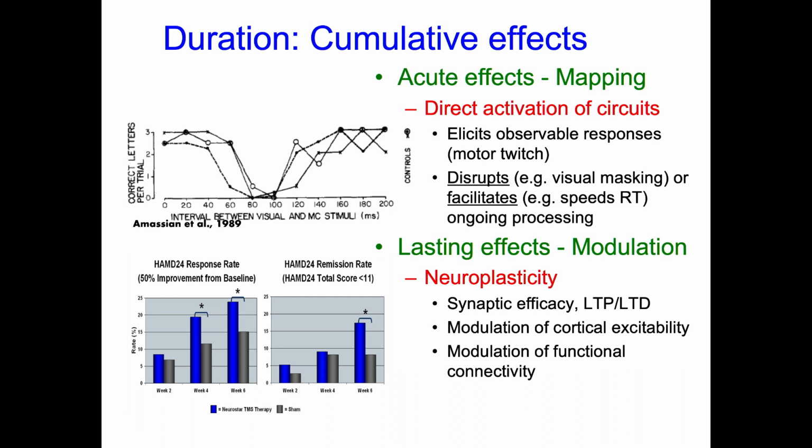That kind of effect, you're changing synapses in a way that the synapses are responding to the stimulation and adapting to it, and they're actually changing their properties, and that lasts for a little while until it all returns to baseline. You can make those changes last a lot longer by repeating over and over these 10, 20, 30-minute bouts of stimulation.